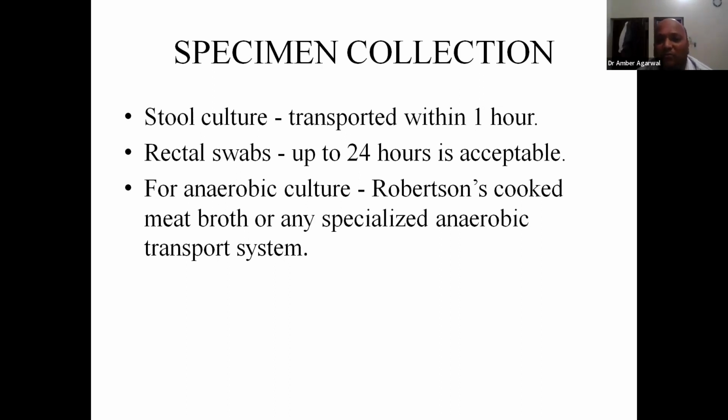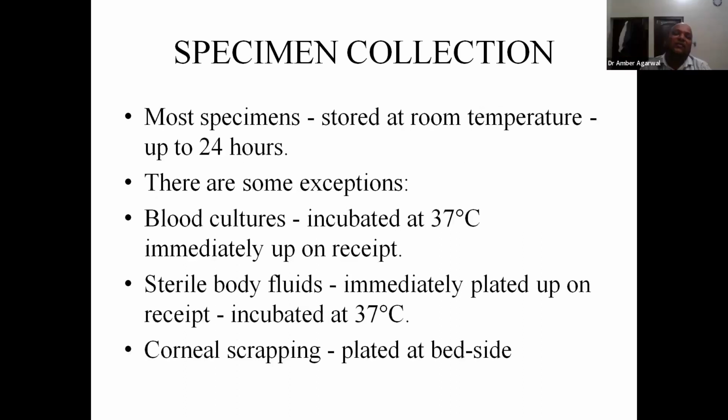For anaerobic culture, as I have already mentioned, you need to send in the Robertson cooked meat broth. Now they say if you are not able to send it in that time, you can store it at room temperature, and blood cultures and sterile body fluids you need to immediately incubate at 37 degrees.